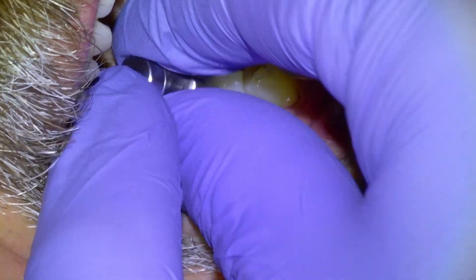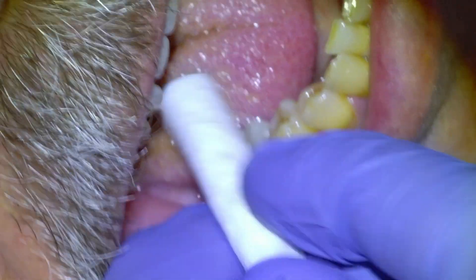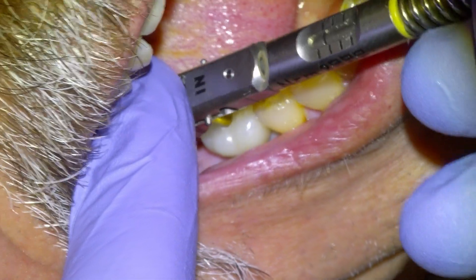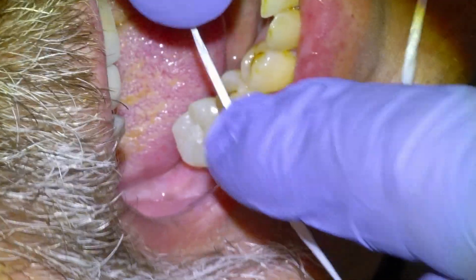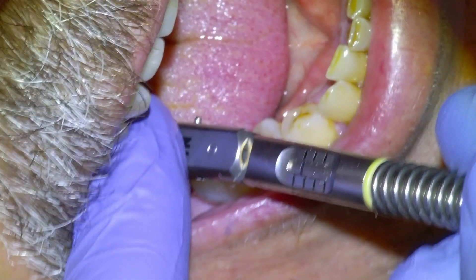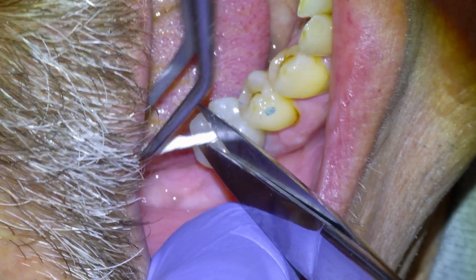We take off the healing cap and screw in the crown with the driver at finger tightness, then typically torque it down to 15 Newton-centimeters. Have them bite down on a cotton roll to make sure it's fully seated with no micro-motions, then torque it down to 35. Once it's fully torqued, check the interproximal contacts and the occlusion. I typically leave implant prosthetics just a hair out of occlusion because there's no PDL, so anything in contact is going to feel like an interference. We dry out the channel and pack in some Teflon tape before putting flowable composite on top.